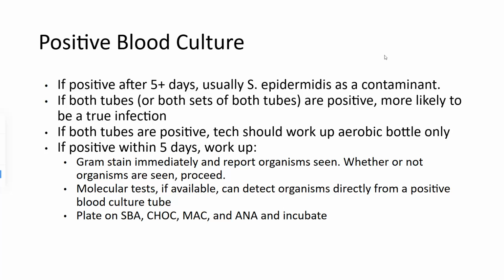If the alarm goes off and it's positive after 5 or more days, usually you'll find Staph epidermidis in there, and that's a contaminant. That's one of the skin bacteria. It takes a while for it to replicate in high enough quantity to be detected by this analyzer. That's why we say 5+ days. At that point, you would still work it up, identify it, and then report that it has been 5+ days, and it's likely a contaminant.